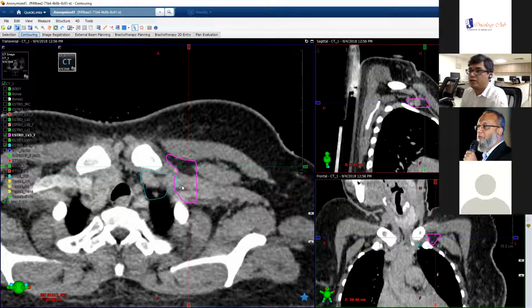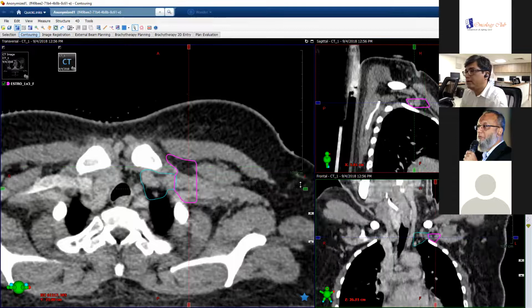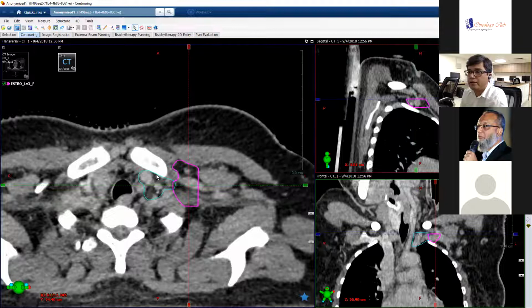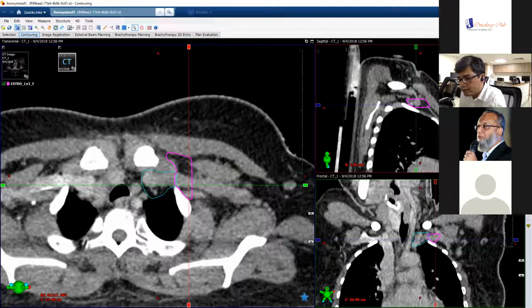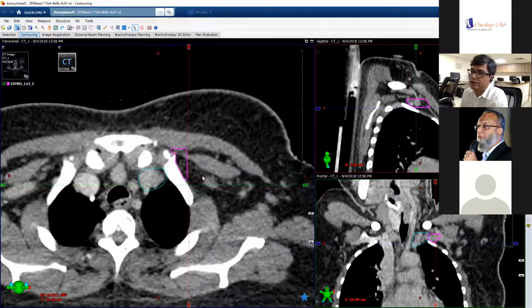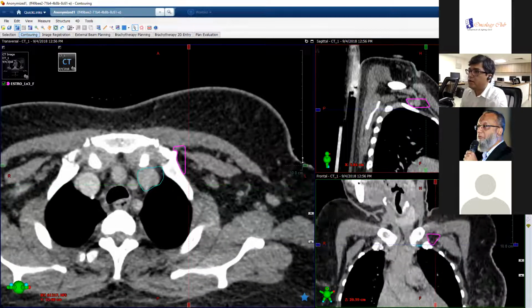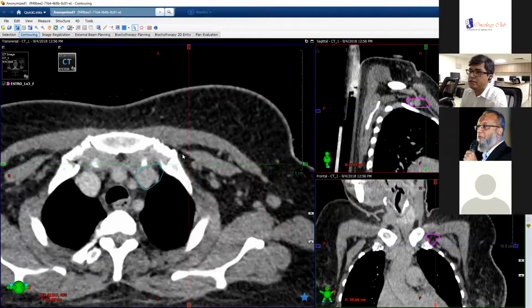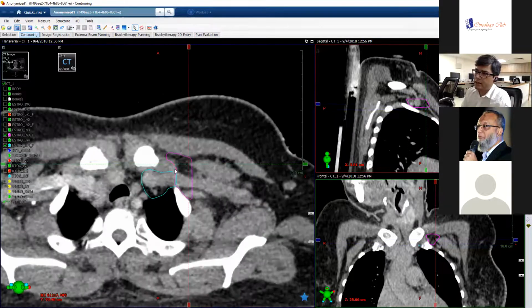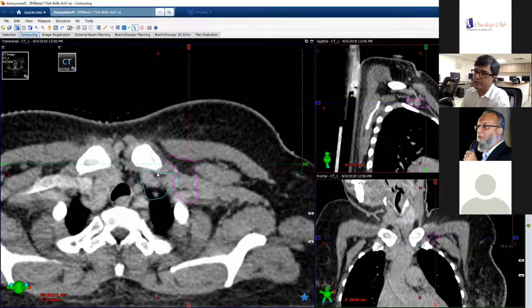The place where you have to start and stop cranially and caudally. Cranially, you have to pretty much start where you're starting your level 4, and inferiorly, you have to stop again, like I said, either where the surgical axillary lymph node dissection has been done, or even further caudally, just including this space till you cannot see it anymore. The medial and lateral borders, like I said, medial connects with the SCF. The lateral border is going to be the medial edge of the pectoralis minor muscle here.